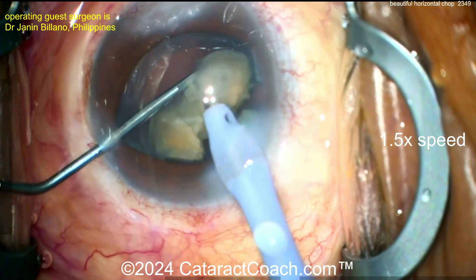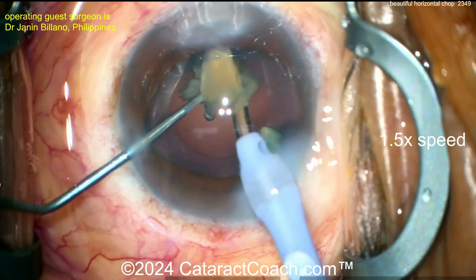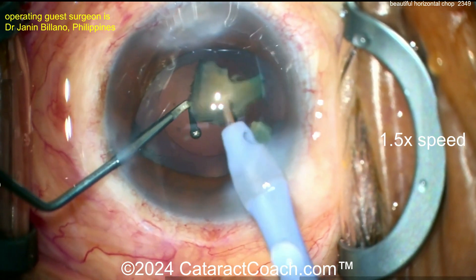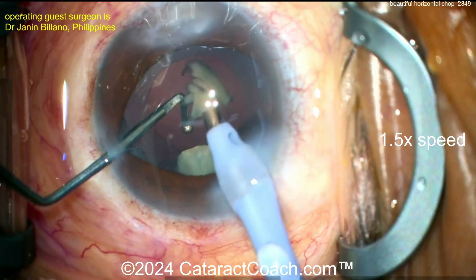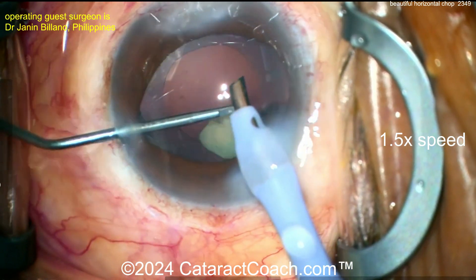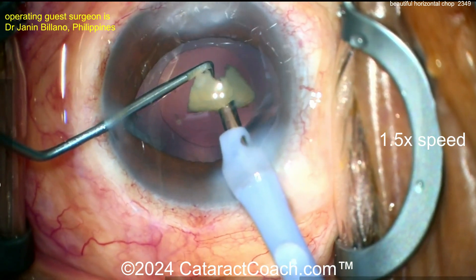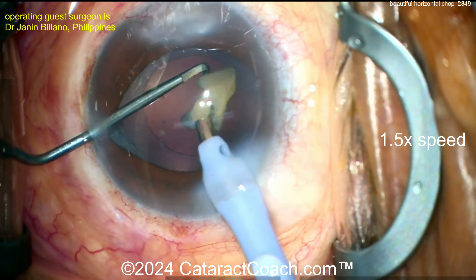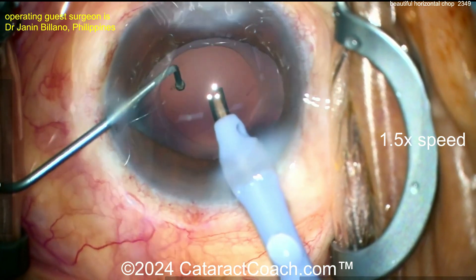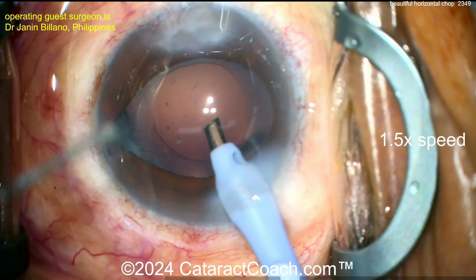Beautifully done. I like the idea of buzzing in just a little bit to hold the nucleus and then bring it up away from the bag. Watch the posterior capsule. In this case there was good anterior chamber stability, so not too much chamber bounce. Notice there's a little iris prolapse towards the paracentesis — keep an eye on that. Here's that last piece — on position one right now. With the piece on phaco, go to position two, and then barely tap into a little burst of position three — burst, burst, burst — and there we go, out it goes.